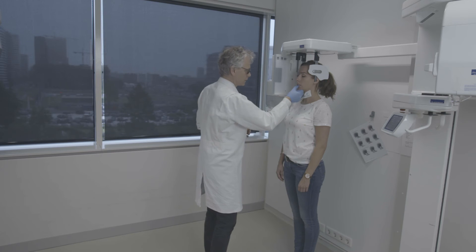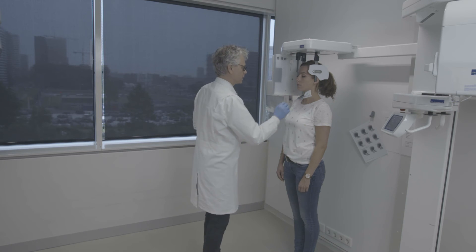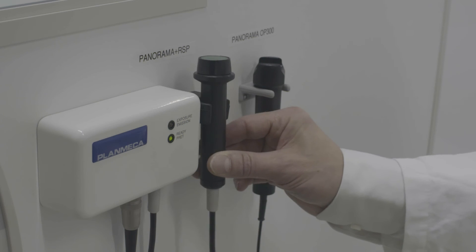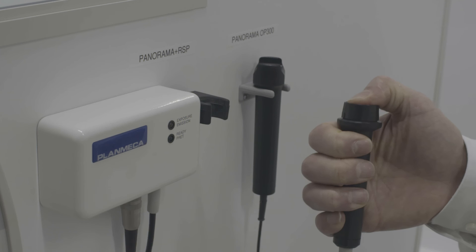The head position, the occlusion and the lip posture are checked again. Now we can perform the exposure for the lateral cephalogram as usual.